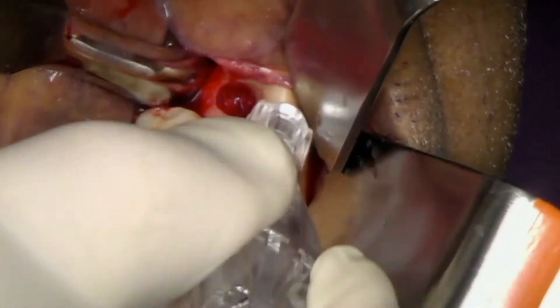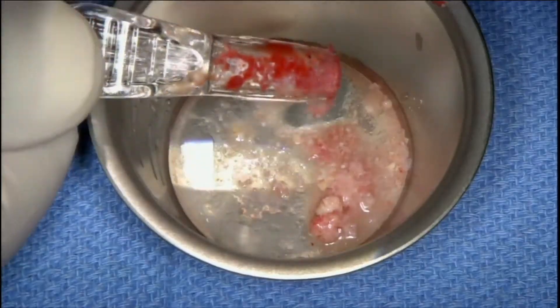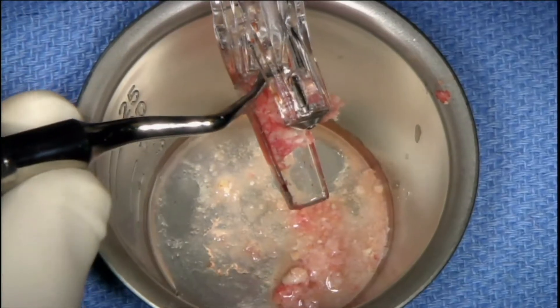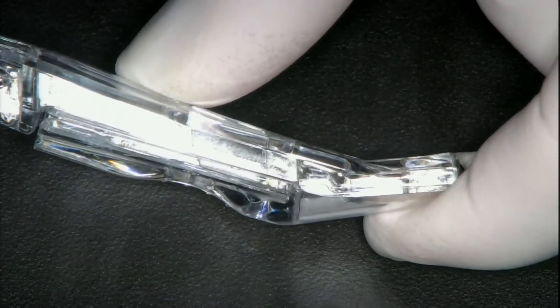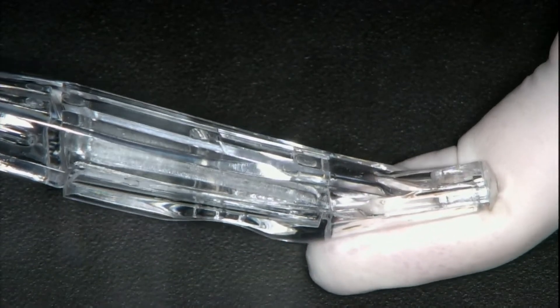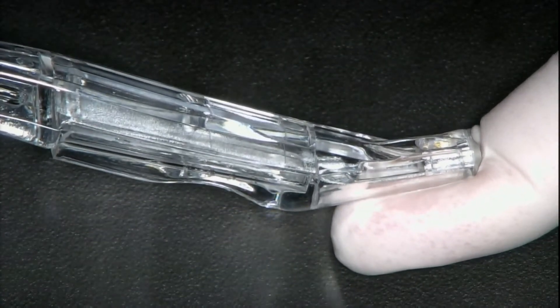This is a great feature as the ramus bone is quite hard and cortical in nature, so the blade can begin to feel dull after two to three scrape cycles with a filled chamber. The chamber is transparent so you can easily see the amount of bone you have harvested. To remove the bone from the chamber, simply slide the handle with your thumb on the chamber, remove the bone, and slide it back. Because this is a plastic instrument, the handle may bend slightly under load, so during scraping you might lose some of the exerted load and the blade may not engage as deeply or aggressively as you may want.